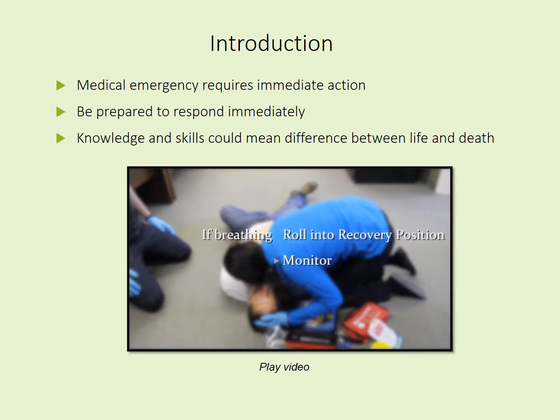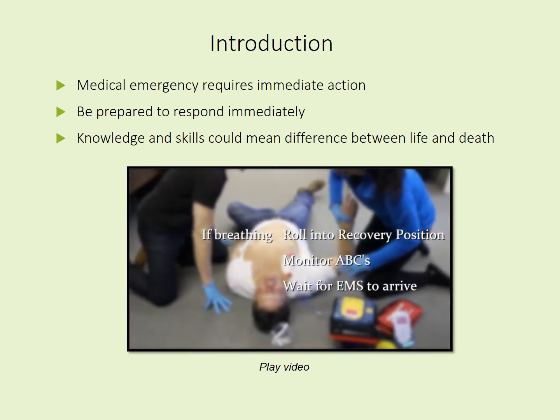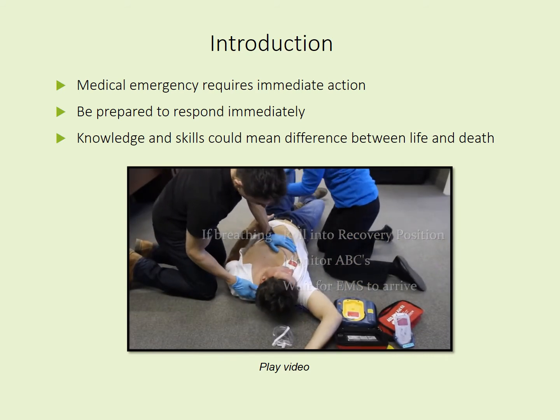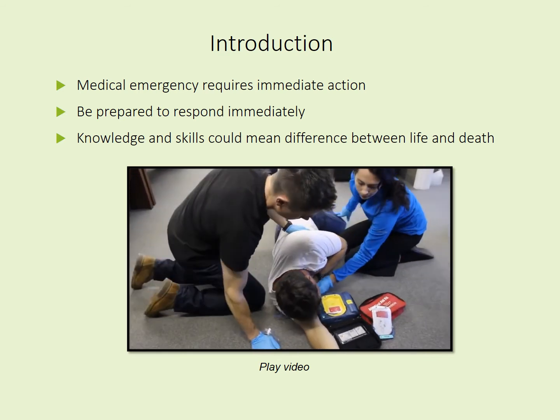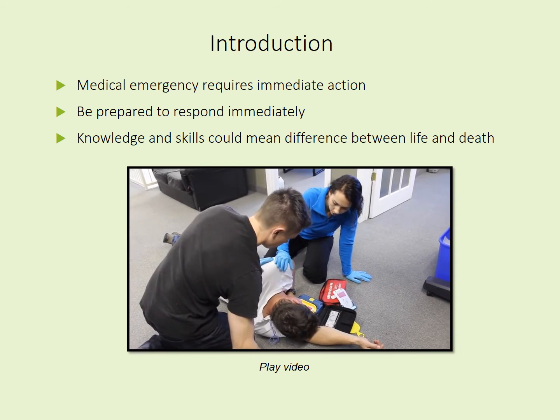If needed, begin CPR. He's breathing. Okay, let's roll him over. Press the flashing blue button. Roger, it's okay, Roger. Just relax. Okay, all right. 45 seconds until analysis will resume.